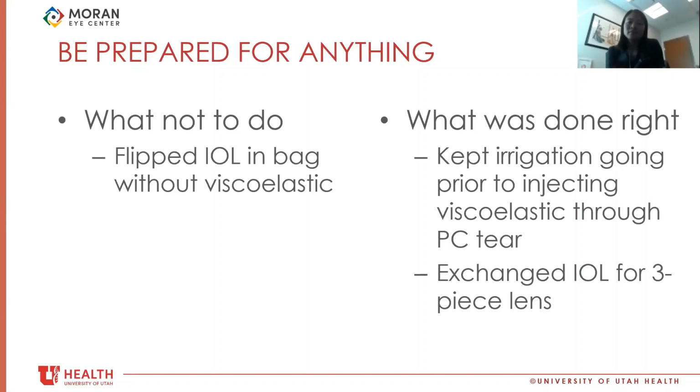But I think the other thing also is your way of explanting the lens. So do you prefer this way over cutting the lens or Pac-Man? Yeah. I've cut the lens on occasion, and if I cut it, I hold the optic with an MST forceps, cut most of the way through, and pull the whole lens out. I've done it that way. I just don't want anything sharp being introduced to cause more damage back behind. So that's why I do it this way.